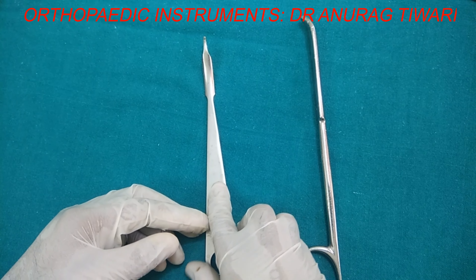There are two retractors. The Langenbeck retractor is L-shaped and is used to retract soft tissues, muscles, and fascia during surgery with the help of an assistant. The self-retaining retractor has a self-locking mechanism — once applied over the soft tissues it holds open on its own without needing an assistant to hold it.